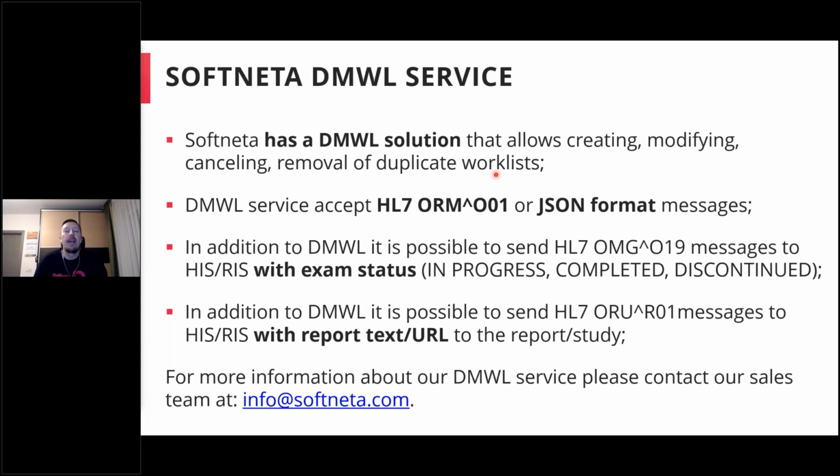Our service can accept HL7 ORM messages, and we can also accept messages in JSON format, because we have some clients who prefer to send these order messages in JSON format. So we have this option available also.